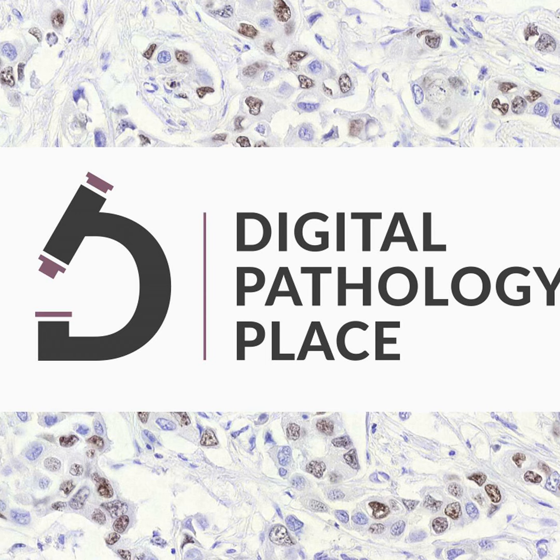The traditional workflow for veterinarians is they will want to sample a mass and then they will either look at the sample themselves in their clinic and try to make a decision about what they're seeing, or they'll send it, well, sometimes I do both, they'll go ahead and send it to a clinical pathologist for expert review. And the challenge in the past has been for veterinarians in some cases, there is an associated cost with sending in those slides to a pathologist to review.